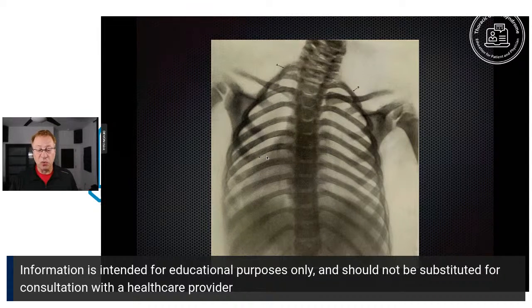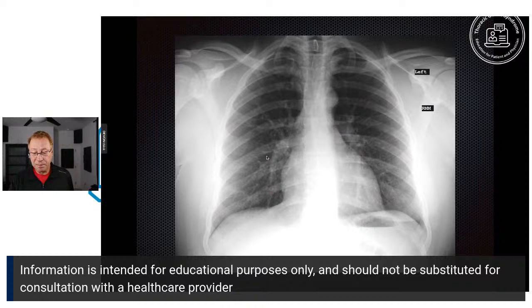You can see cervical ribs if you look closely at the top. Right after Röntgen discovered X-rays, people found that patients with these strange symptoms in the nerves of their arms had an extra rib, a cervical rib, on this new fantastic X-ray. And so they came up with the name Cervical Rib Syndrome. But it's not as simple as all that.